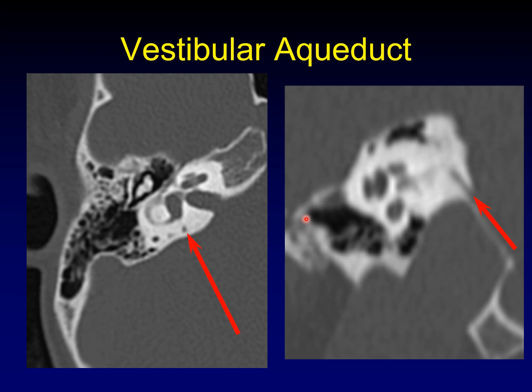Everyone's familiar with the vestibular aqueduct. This is just to show you where it is normally on an axial image. If you're having trouble seeing it on an axial image, it's better depicted on a sagittal image like here. If you do an oblique reconstruction, you can really lay it out beautifully and show how its posterior end flares out, but usually you can tell just from the axial images if there's anything abnormal about the vestibular aqueduct.